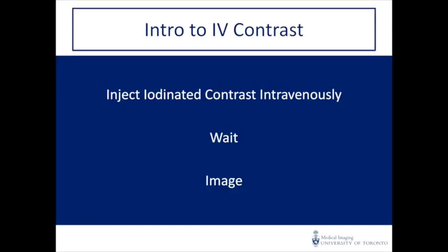So let's change gears a little bit here and add IV contrast. Contrast completely changes the game, and there are a lot of things to know about IV contrast. But the very basic principle is simple. We inject contrast that is iodinated into the venous system, or intravenously. We wait a certain amount of time, and then we image the patient.